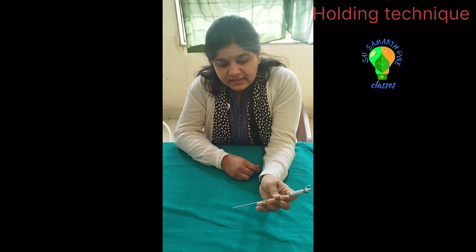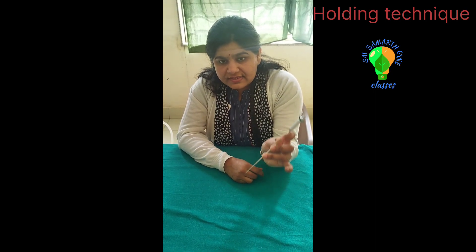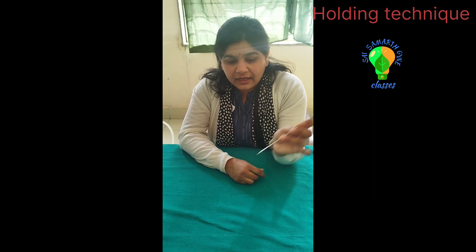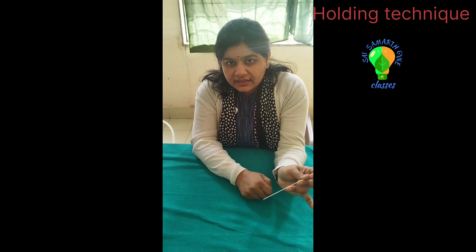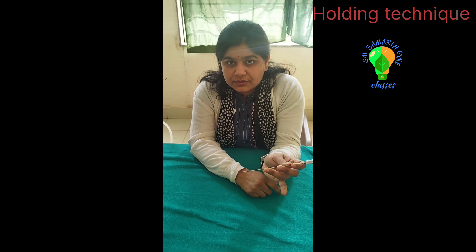You should guard the Veress Needle and hold it like a dart. This is the guarding finger — because of your hand position you should hold it this way whenever you are inserting.